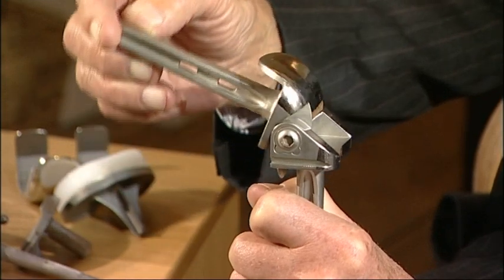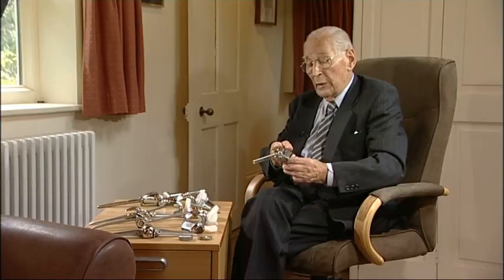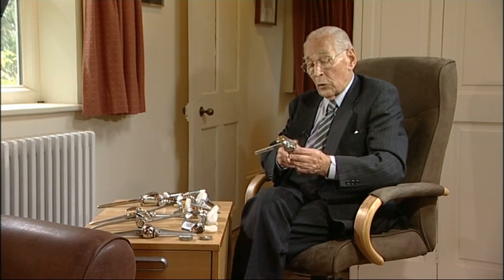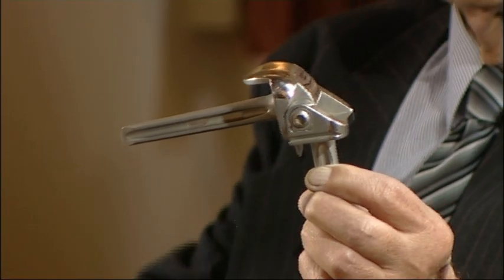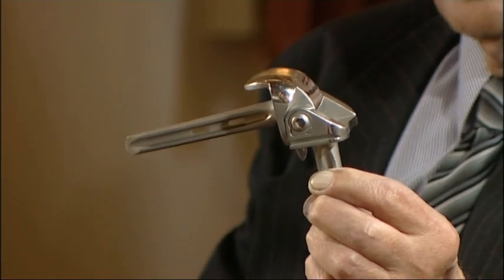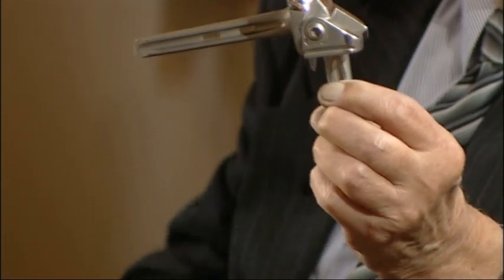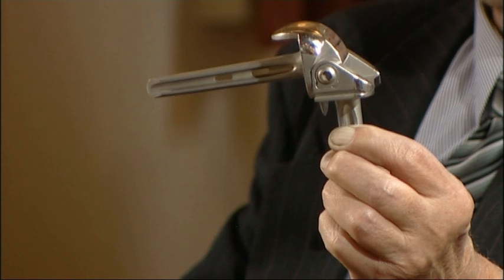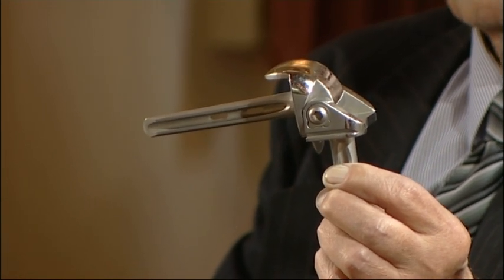You opened up the knee joint, you divided the femur at its lower end transversely, you took off the top of the tibia and all the ligaments, of course, associated with it. You could then insert this bit, the femoral bit, up the shaft of the femur and the tibial bit into the center of the tibia. You put the screw in and your joint was then mobile.